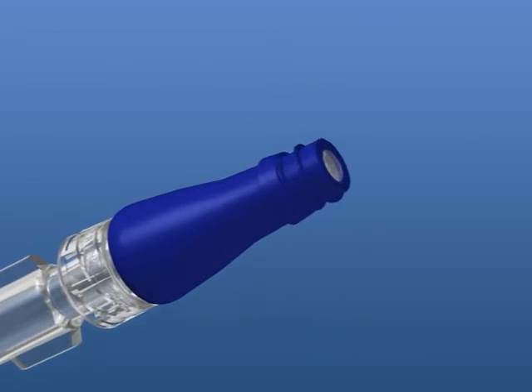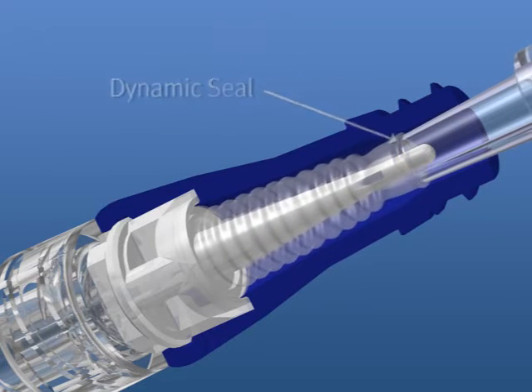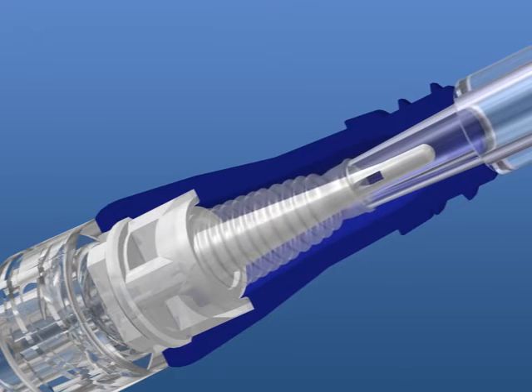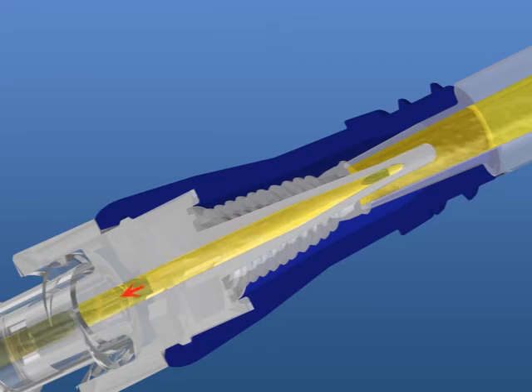As the access lure contacts the sterile silicone surface and begins to compress the septum, a dynamic seal is created and the internal blunt cannula begins to pass through the split septum. Not until the silicone is compressed and the windows of the cannula become exposed in the internal diameter of the access lure is the fluid path accessed. This creates the dedicated internal fluid path where at no point does the exterior of the access lure, split septum, or housing come in contact with the fluid path.